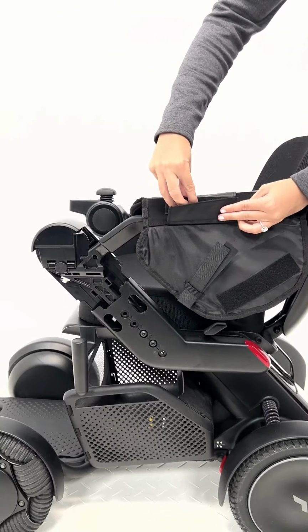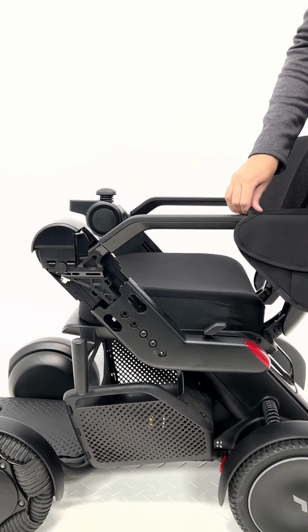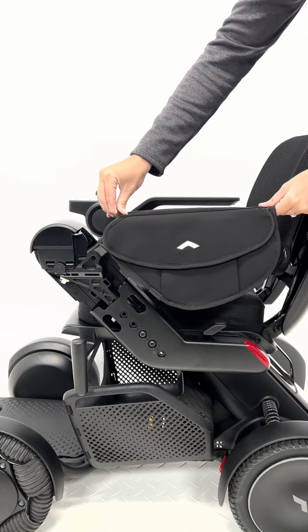Securely attach the Velcro pieces in the middle of the arm bag to each other, leaving enough space for the armrest, and then slide the arm bag over the armrest from the back.